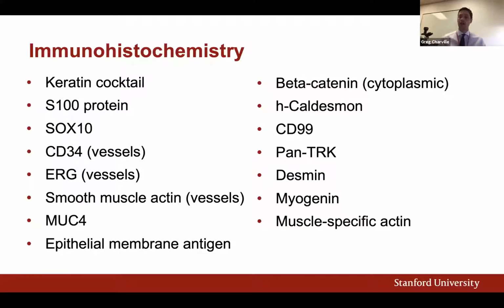I think it's a good hypothesis. Whenever we see a bland spindle cell neoplasm, particularly in a child, we're thinking about NTRK-related fusion neoplasms, but as many of you know, many other kinases translocated in similar-appearing tumors have also now been described. Again, I'll highlight, oftentimes we see CD34 and/or S100 immunoreactivity in those tumors, but not always. Certainly, we've had NTRK and other kinase-rearranged sarcomas that do not express CD34 or S100. So I think that remains on the differential diagnosis at where we stand right now.